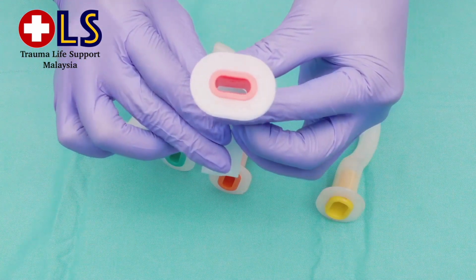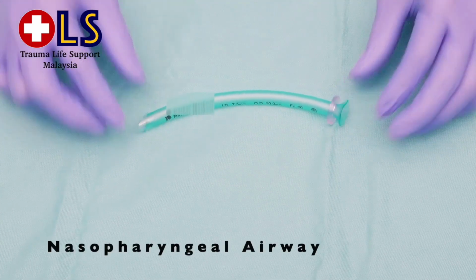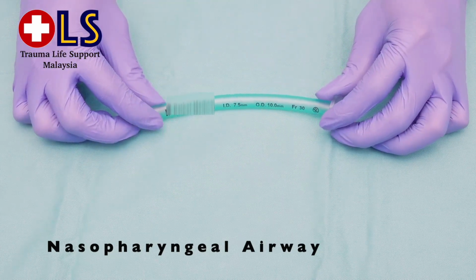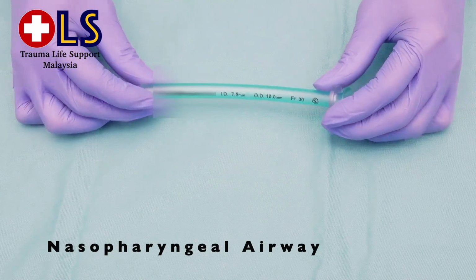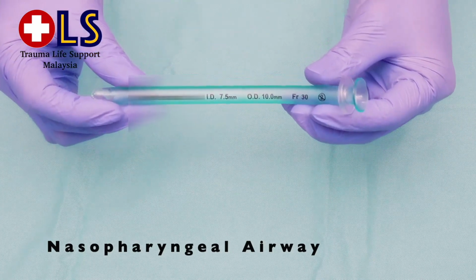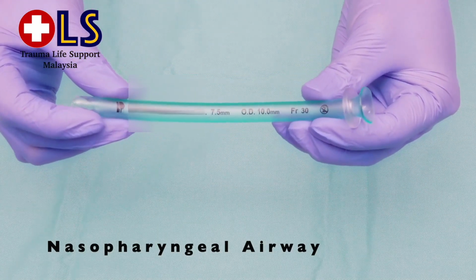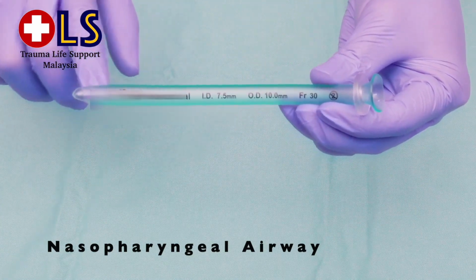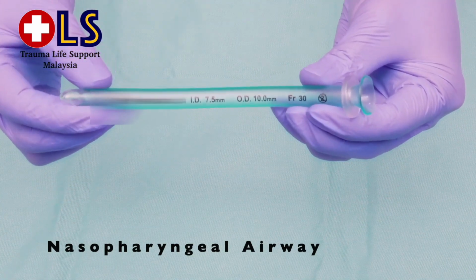This is Nasopharyngeal Airway, known as NPA. It is an airway adjunct to help to obtain and maintain open airways. It can be used on semi-conscious patients or unconscious patients with gag reflex. It can also help in patients who need frequent nasal tracheal suctioning.